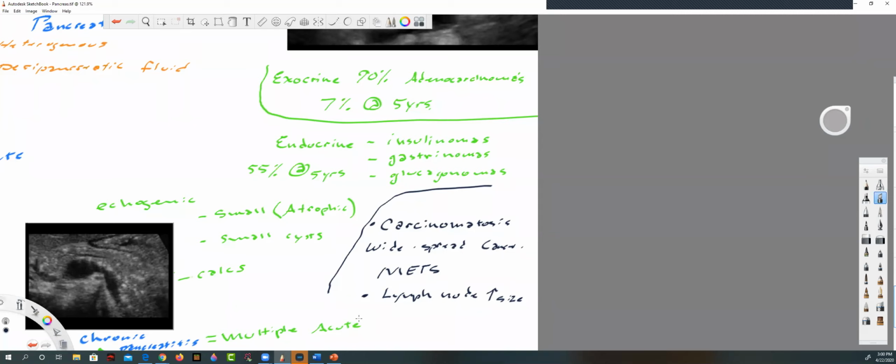The fact is that solid tumors can look either way: hypoechoic, hyperechoic. Blood flow in them, so always use your Doppler. And those are the vast majority of cancers. Tumors in general, and cancers as well, are solid. The amount of cystic cancers is 1%. So the vast majority of cysts that you see on the pancreas are either simple cysts or pseudocysts, but they are very unlikely to be cancer.